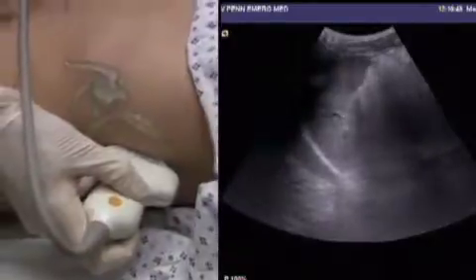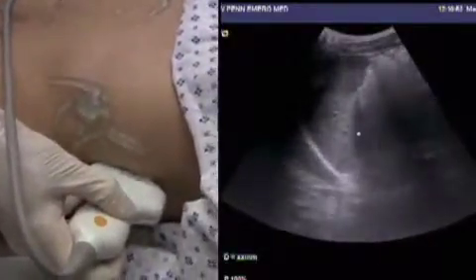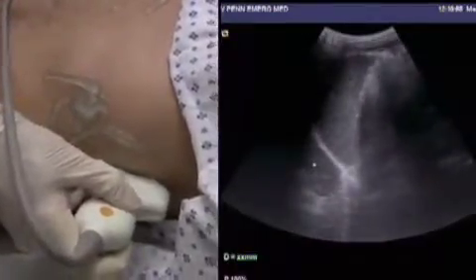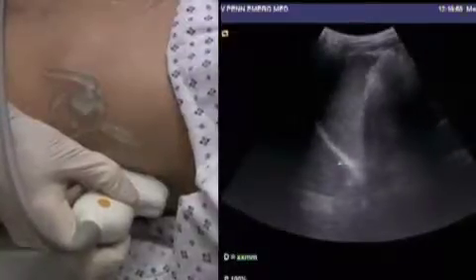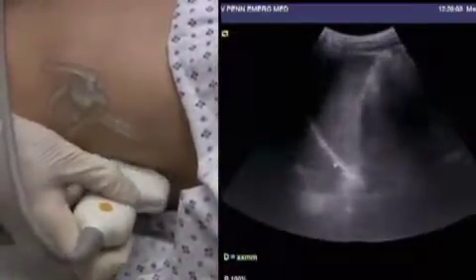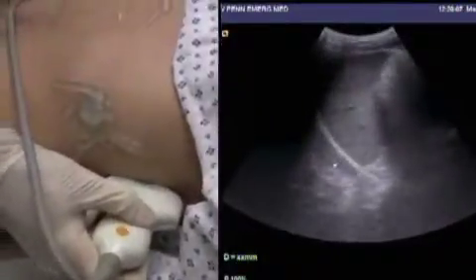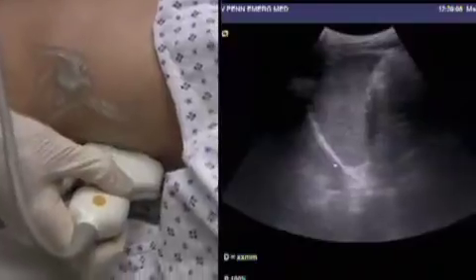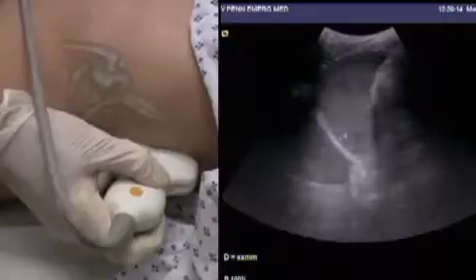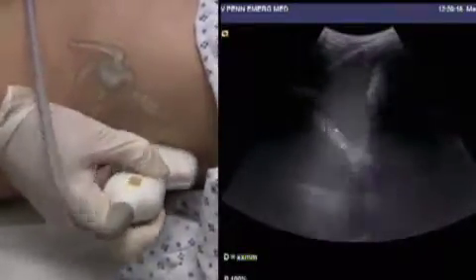We have the diaphragm as on the right. Above the diaphragm, we have mirror artifact suggesting that there's no hemothorax, and we scan through the whole space available to us. Our probe is further cephalad and further posterior than one might expect. Underneath the diaphragm, there's no fluid either. The spleen is clearly seen here, and the entire diaphragmatic surface of the spleen can be analyzed from side to side.